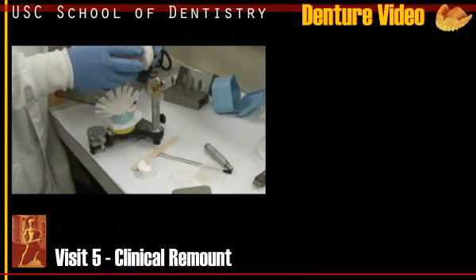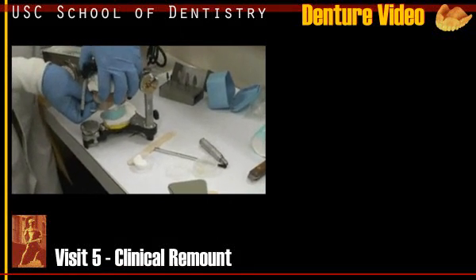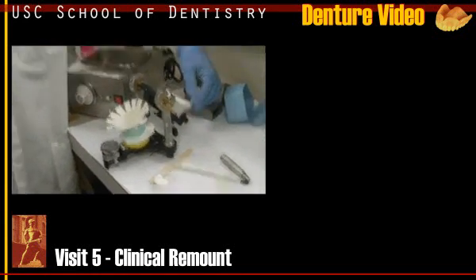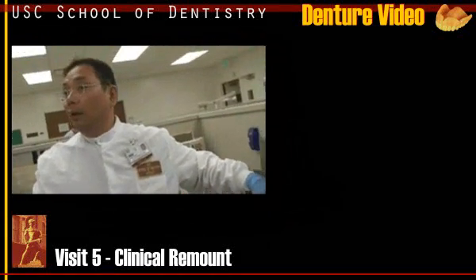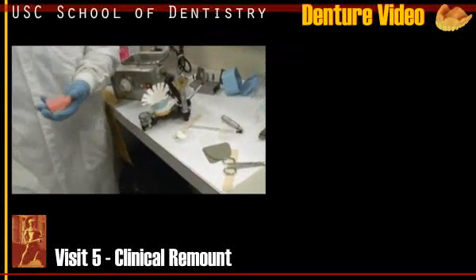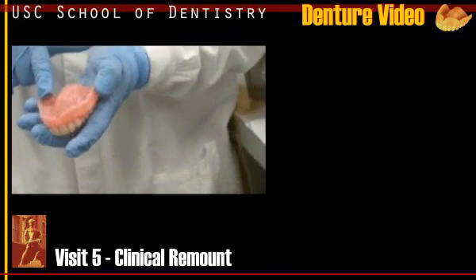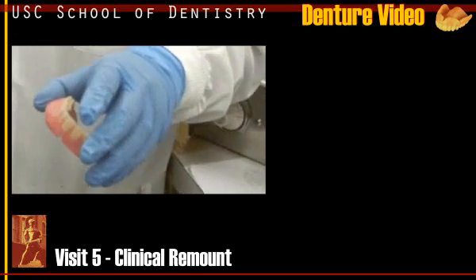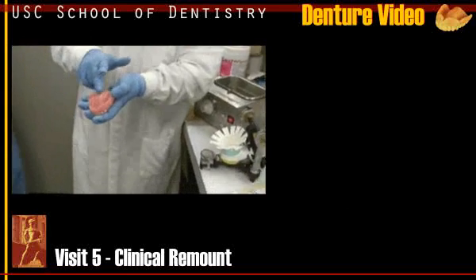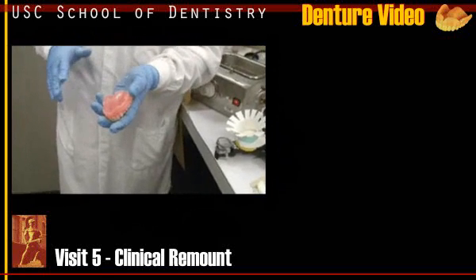And then if you make an indentation, right? Then that's already a face bow transfer. So you can just mount that plate with plaster. Mount it already, okay? Then there's a question you might think, oh my God, I changed the border, is it going to fit or not? Okay, it still fits because there is some palatal area which has some reference point, right? So it will fit, okay?